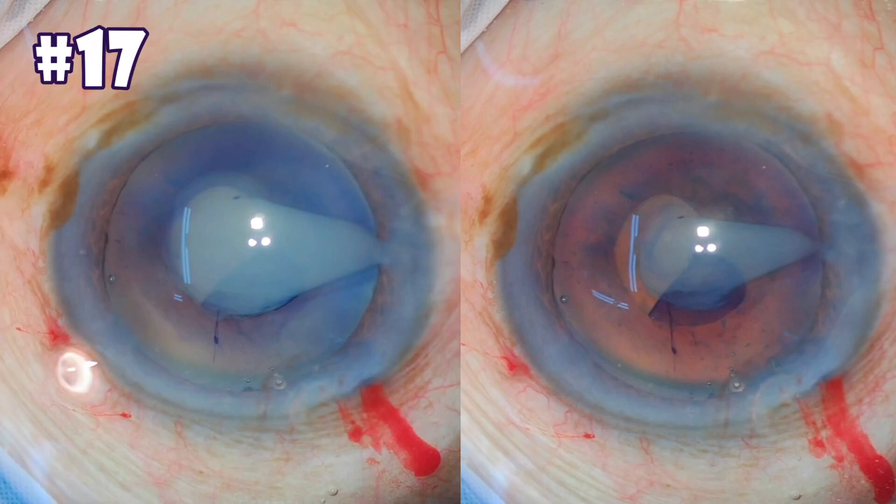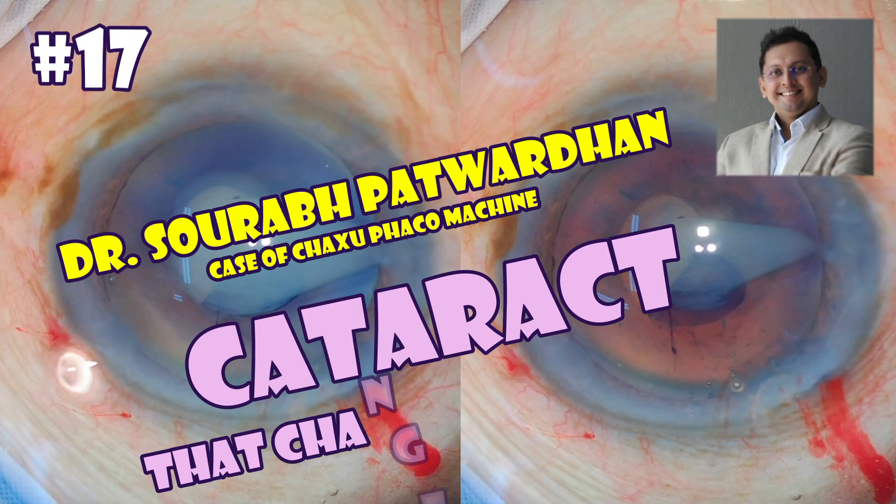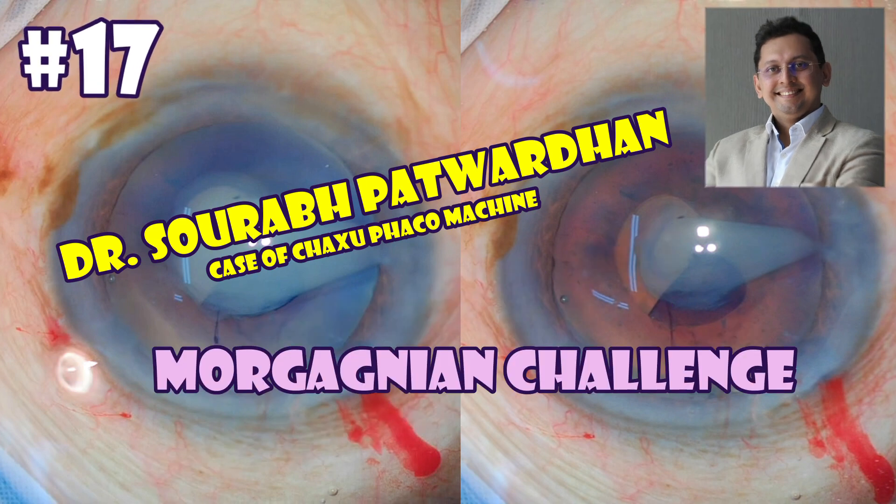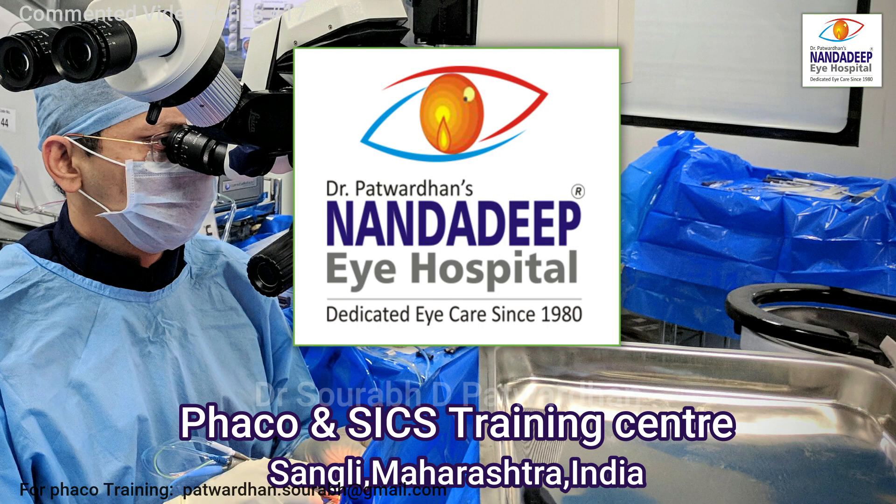Hello friends, this is Dr. Soura Patwadhan from Nandadeep Eye Hospital and Phaco Training Centre, and in this video I will be speaking about a cataract that changed colour. This particular Morgagnian cataract is operated on the Chaxu phaco machine.